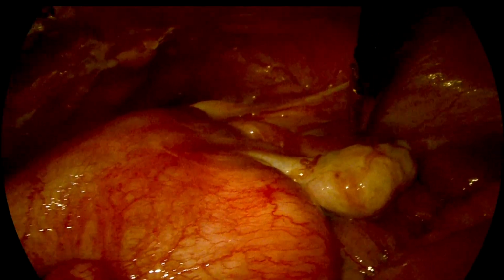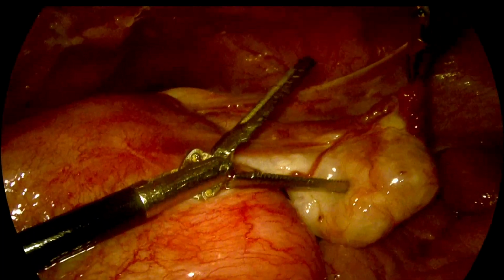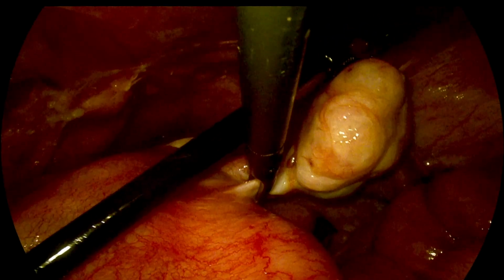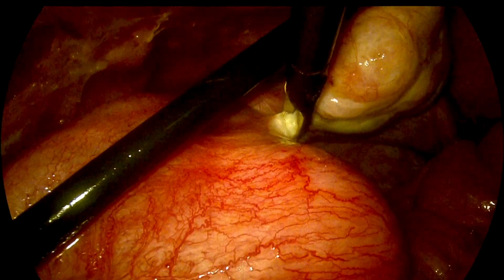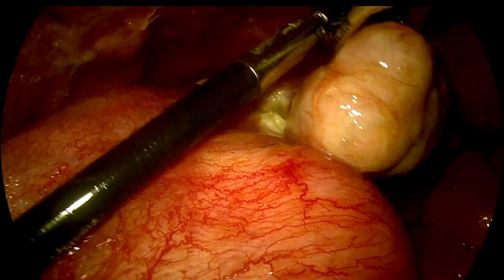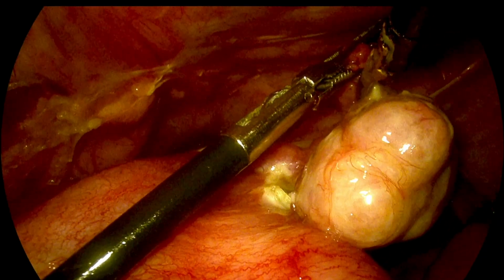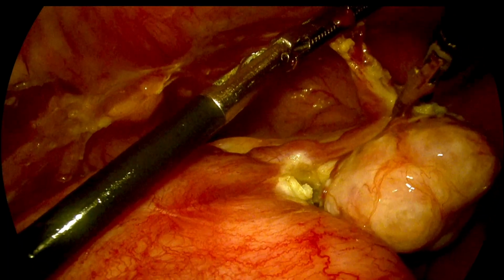Now we're trying to start the dissection from the right side. On the right side, we can see there is an ovary present. The fallopian tube is also present. We are trying to preserve the ovary on the right side and start the surgery by doing ovarian ligament division, as this is more exposed than the mesosalpinx. Otherwise, you would have started with the round ligament and then gone back to the infundibulopelvic ligament and mesosalpinx. Here we are starting with the division of the ovarian ligament and then division of the mesosalpinx.